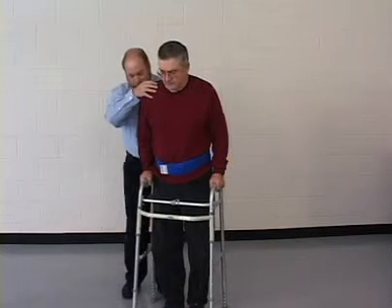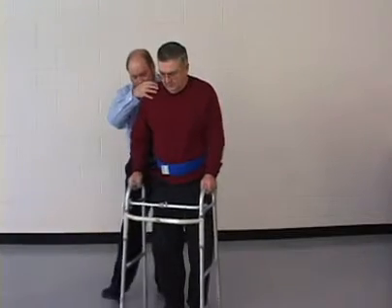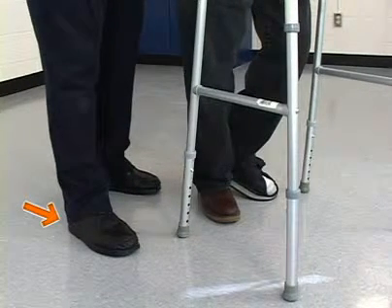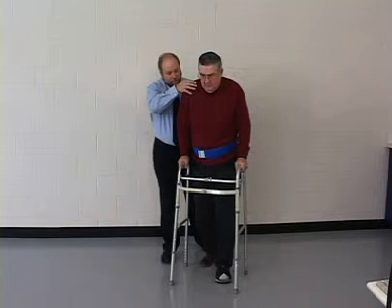The walker is lifted and advanced forward. All four legs of the walker must be lifted from or lowered to the floor simultaneously. As the patient moves the walker, the therapist advances his right or outside foot. The patient then advances the involved lower extremity, moving into the strength and stability of the walker. Then he bears weight through his upper extremities as he advances his uninvolved lower extremity.